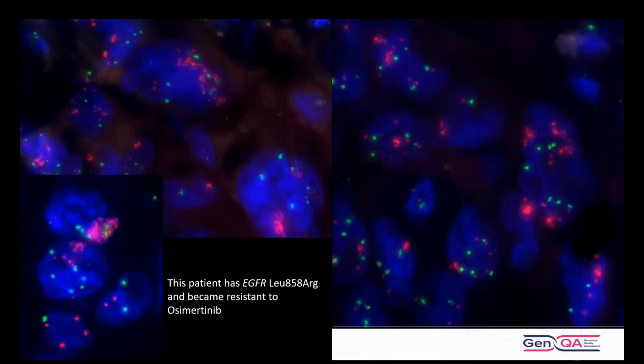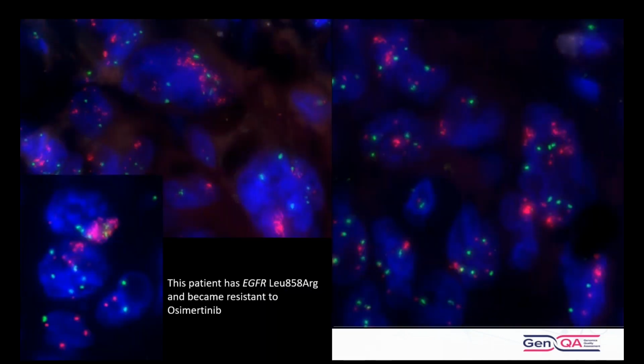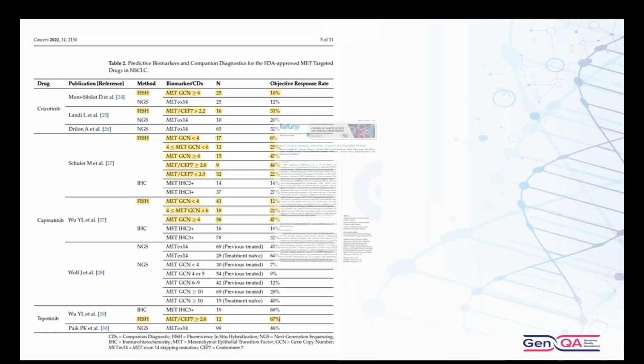And then this patient, this is one that we looked at recently. This patient has got an EGFR L858R, and they've been treated with osimertinib, but they're resistant to osimertinib. And this is the MET FISH, and you can see why. But as opposed to the previous cell, where you've got really clearly defined amplification that's separate, it's probably double minutes within that cell. This, you've probably got a HSR because you've got really big clumps of red that in some cells just look like autofluorescence, but actually once you start looking around, you can see that that is amplification. But this is hard to score accurately because you can't see clearly defined signals, but you can see that you've clearly got amplification there.